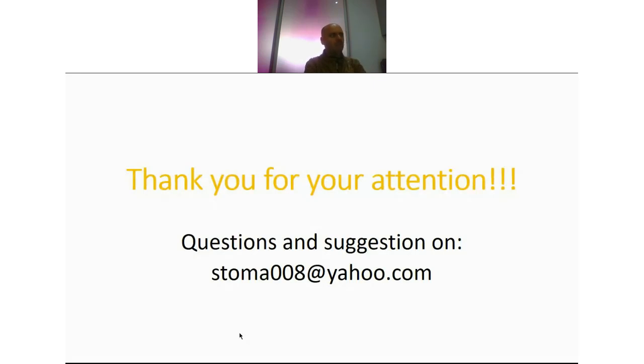It would also be important to say that when we are talking about navigational surgery, we have a completely different procedure to match data, which is called tracing. But we will leave that for some other meeting or workshop or webinar.